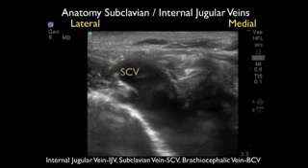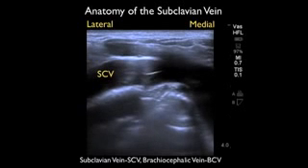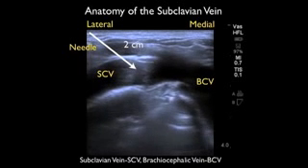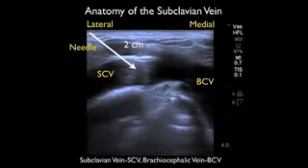All we're doing is a slight anterior tilt with the probe to visualize the subclavian vein running into the brachiocephalic vein. The depth markers show the subclavian vein located at about one to two centimeters — a relatively superficial structure. In another ultrasound image, we see the subclavian vein coming from lateral and joining with the brachiocephalic vein medially, with a valve visible at the confluence. Our needle would come in from the lateral aspect aimed medially, traveling about two centimeters to successfully cannulate the vessel.